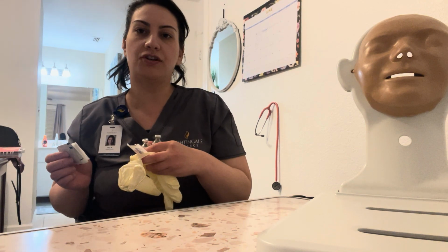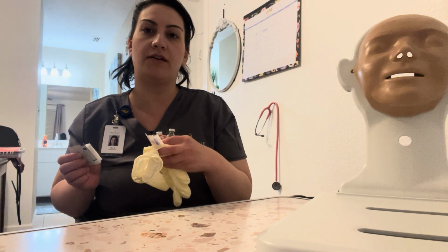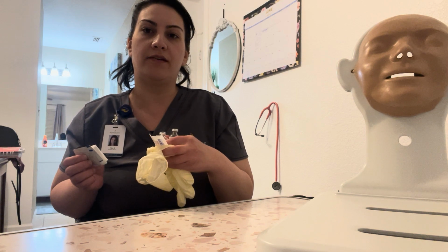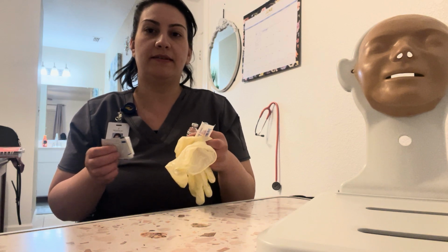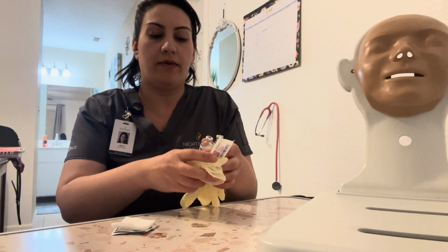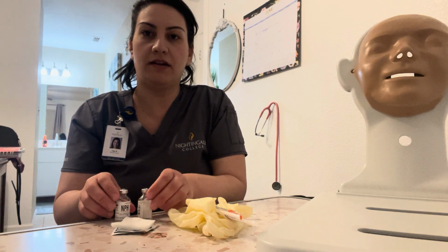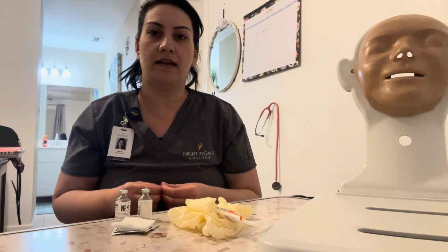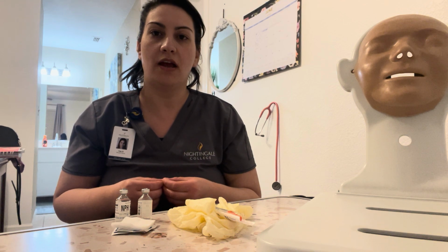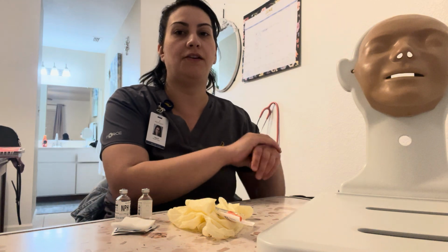I will knock, enter, and close the door behind me to avoid any HIPAA violations. I want to make sure that there's no family members in the room, and there isn't. I'm going to set my supplies here on a clean, dry surface. I will be giving my patient regular insulin, which was 4 units, and 8 units of intermediate NPH, equalizing 12 units of insulin. I will go ahead, hand hygiene here.